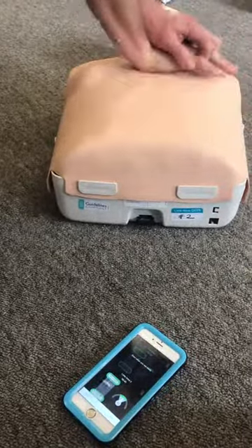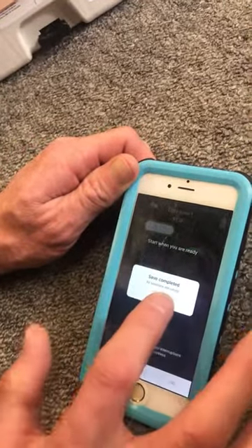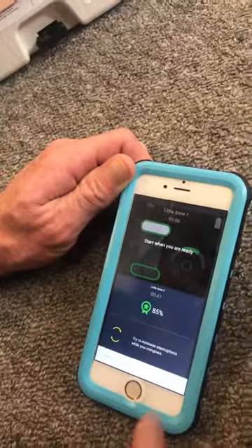When we're finished, if I push end, I've ended up with 85% out of 100% in terms of my efficiency. If someone else had been using little Annie one at the same time, both results would come up on the screen. From here I can actually save those results — it says would you like to add names, so I push add names, and under my result there I can put my name and push done, and then push save. Then from the top left here, I can go into saved results.